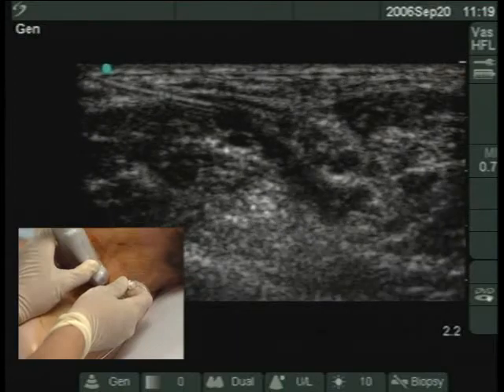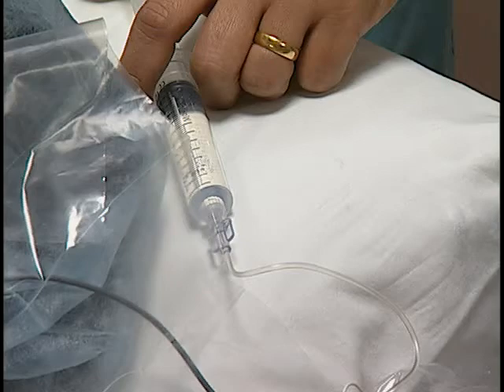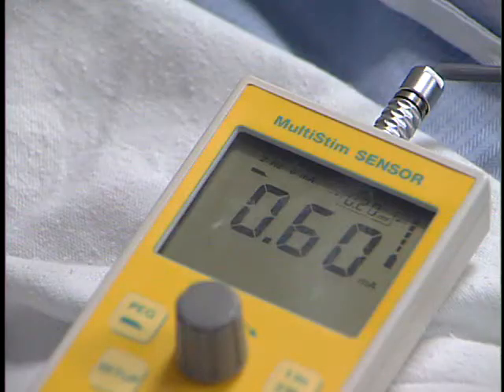The needle is connected to local anesthetic of your choice and a nerve stimulator, which is set to deliver 0.6 milliamps of current at 2 hertz frequency.